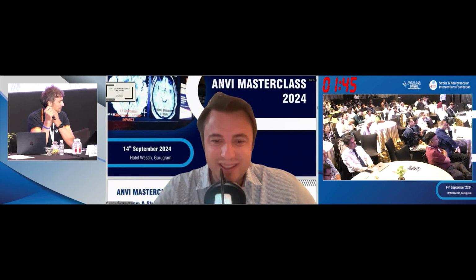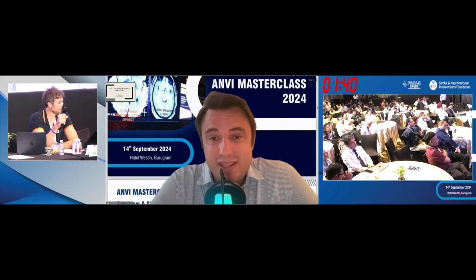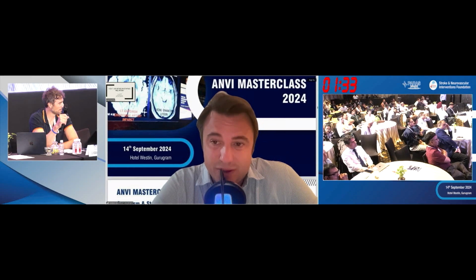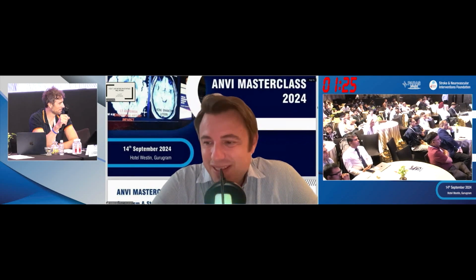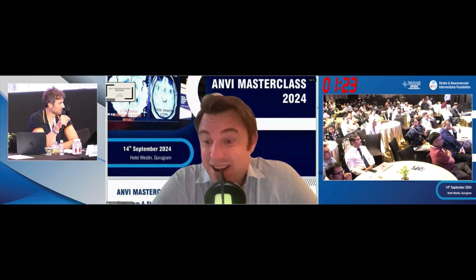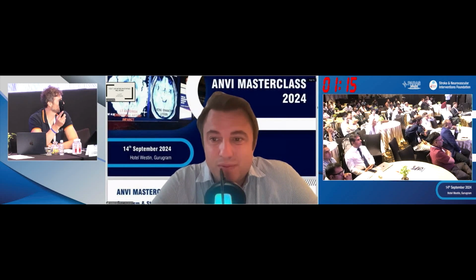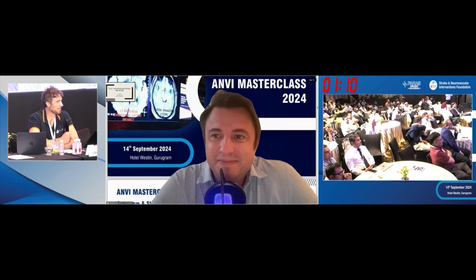Thank you, Vincent. Yes, we tried several things. We didn't try, in the end, to use a stent retriever or a snare. We thought about that, but placing a snare inside the aneurysm could be an option for sure. It is the first time that I had that complication. Terrible, believe me, it was a nightmare for us. But any option is okay. It's a good suggestion. Whatever you have on the shelf to try to remove it or change it is good. But we didn't try that maneuver. Maybe next time.